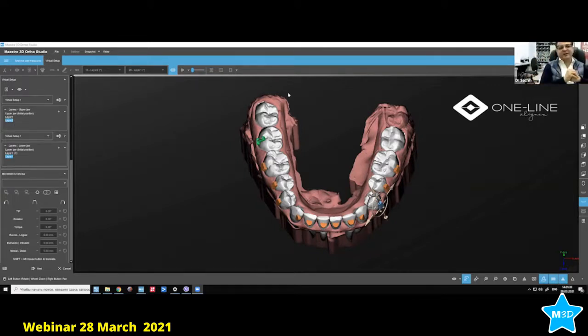So he uses the OrthoPulse appliance, which is photobiomodulation of the teeth. I have not tried it. It's not available in Moldova, so I'm not sure. But velocity will depend on the size of the teeth. The bigger the teeth, the more force you have on the teeth. It's more covered. You can actually move them faster per sheet, not faster per month, but faster per aligner. You can move them depending on the movement which you have planned, on the attachments used, and the sheet.